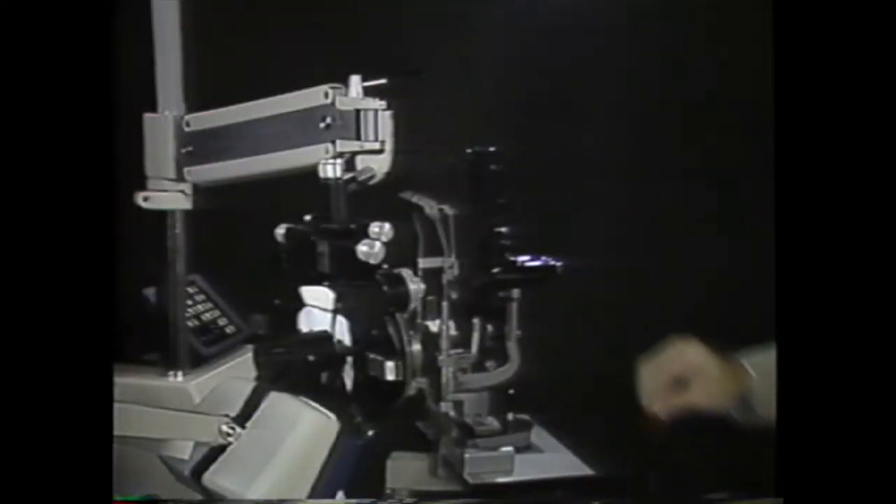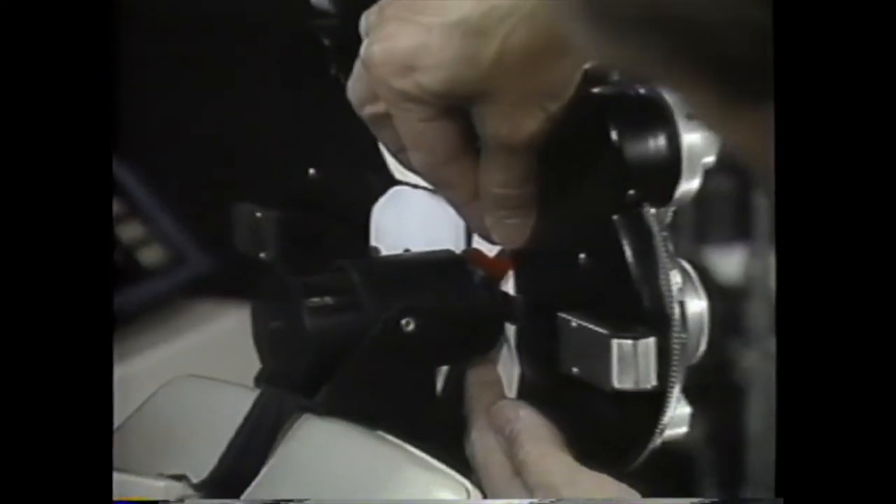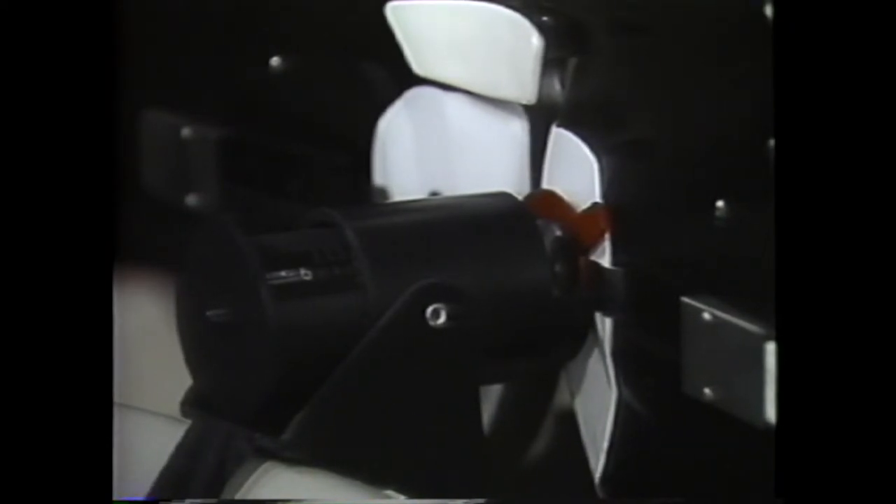Let's give some astigmatism to the schematic eye. Place a minus one-and-a-half diopter cylinder between the schematic eye and the phoropter with axis approximately vertical at about 100 degrees, so the proper correction will be a plus one-and-a-half diopter cylinder, axis 100 degrees.